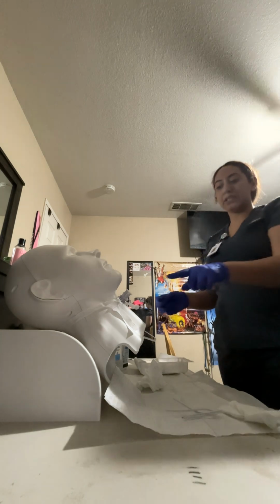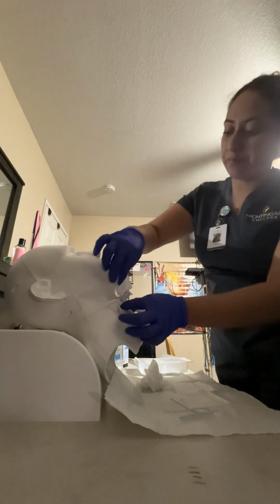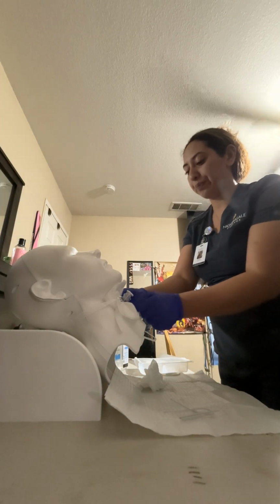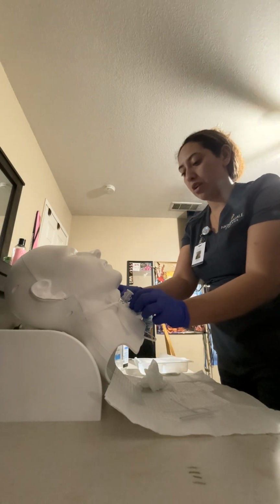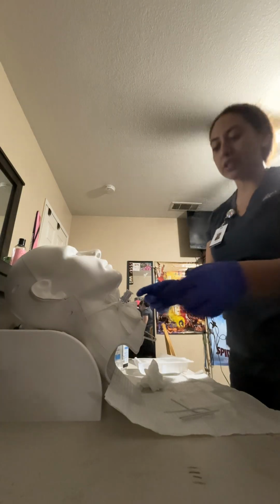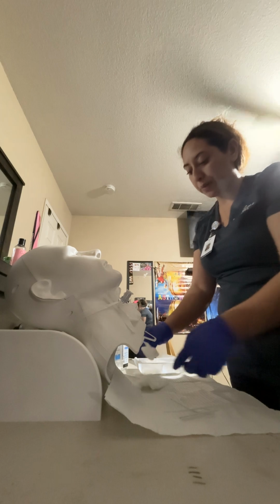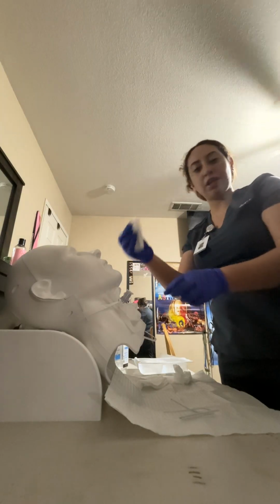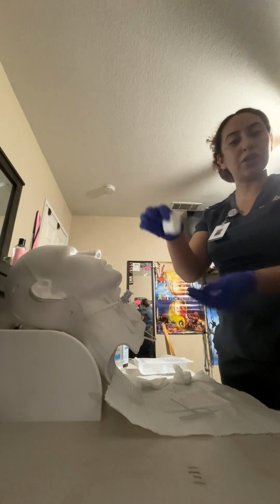Next, I'm going to replace the split gauze around the patient's stoma. Okay. I have replaced the gauze. Because I had tied knots here, to ensure that the patient doesn't get indentions on his neck because of those knots, I'm going to apply a 4x4. We're going to fold that in half, tuck it and tape it, and we're not going to tape it onto the patient's skin, but we're just going to tape it so the edges of the gauze close over.